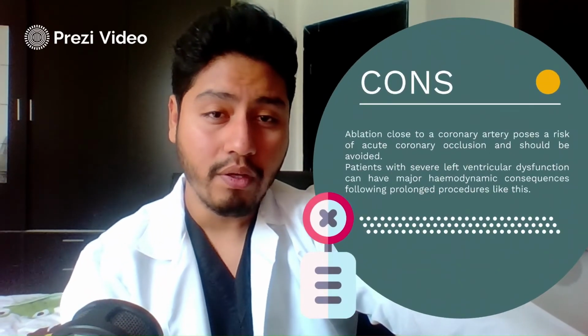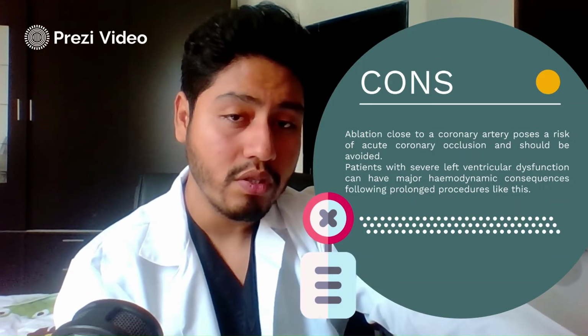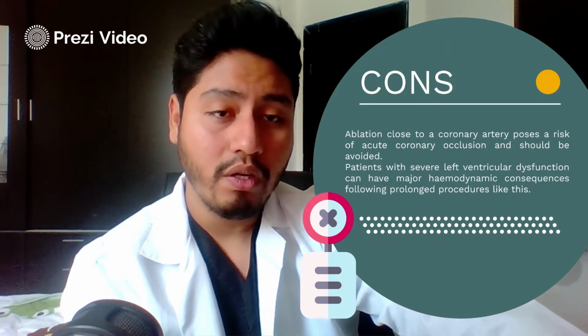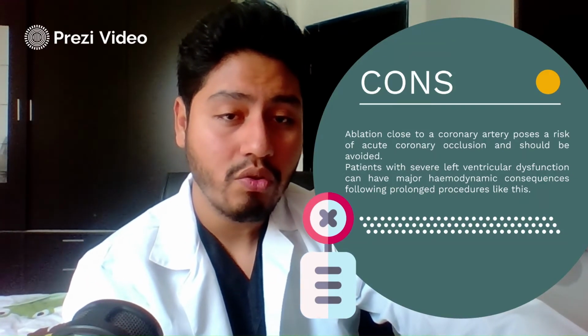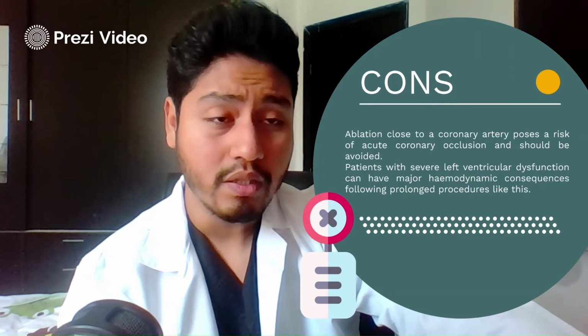In the cons, ablation close to a coronary artery poses a risk of acute coronary occlusion and should be avoided. Patients with severe left ventricular dysfunction can have major hemodynamic consequences following prolonged procedures like this.